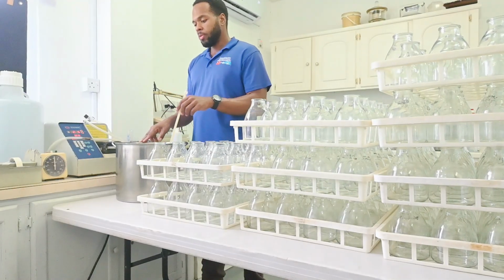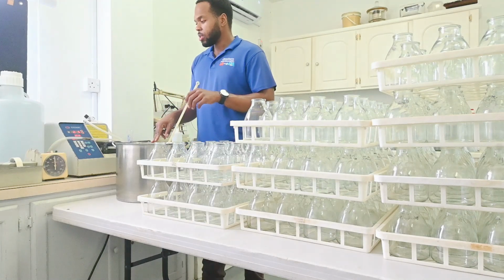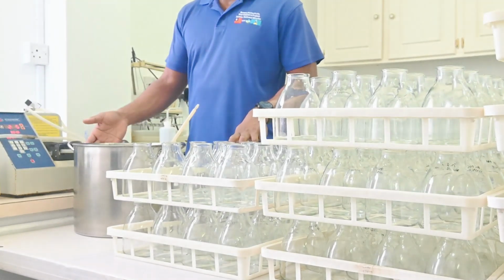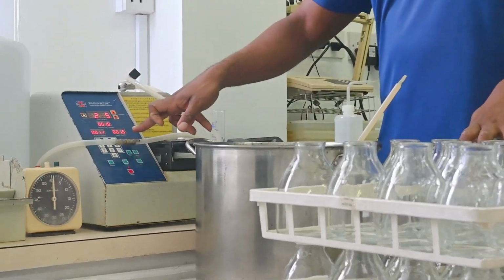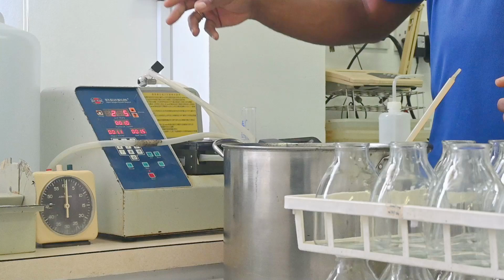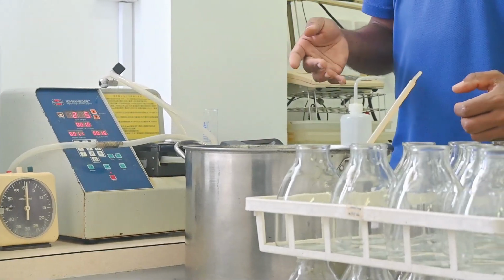So now that we've done checking the pH level, the next thing now is to dispense into the bottles. This is an automatic dispenser. What it does is it takes the volume from the pan. You can set the flow rate, the dispense rate, and the delay time in between when you're dispensing in each bottle. You calibrate the machine for that, and it dispenses that exact amount into each bottle, so it saves you a lot of time.